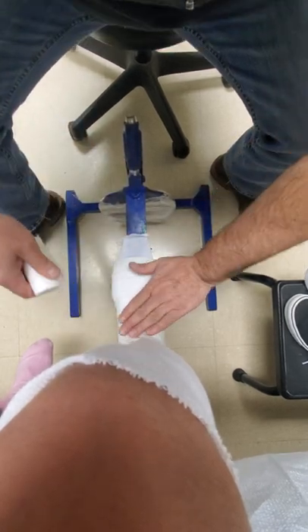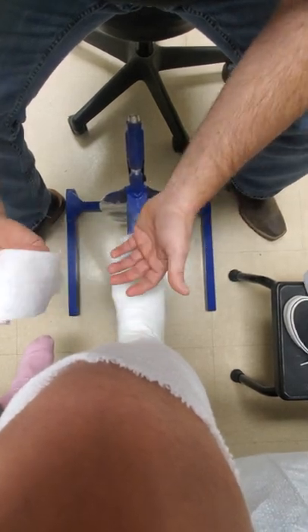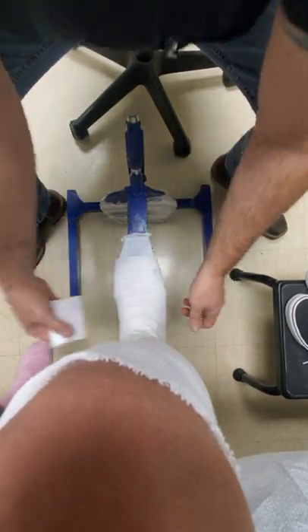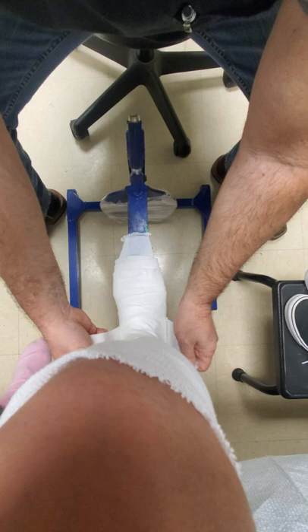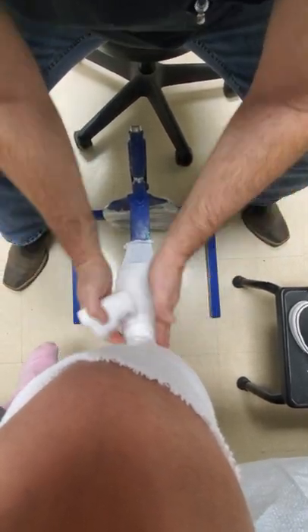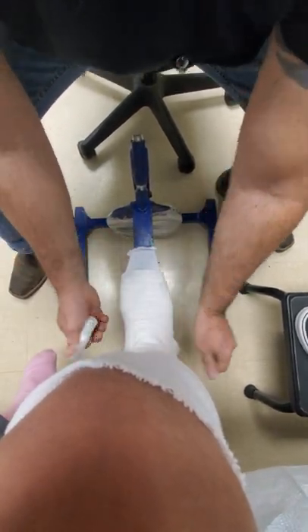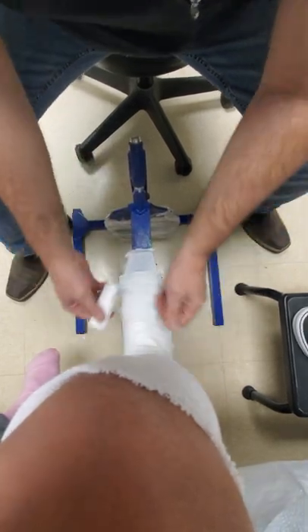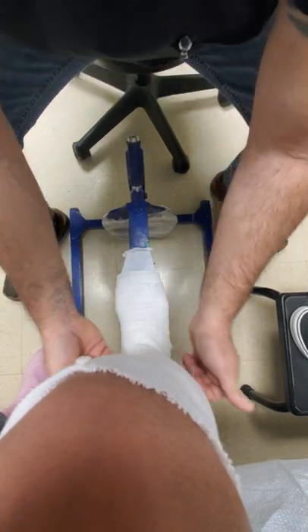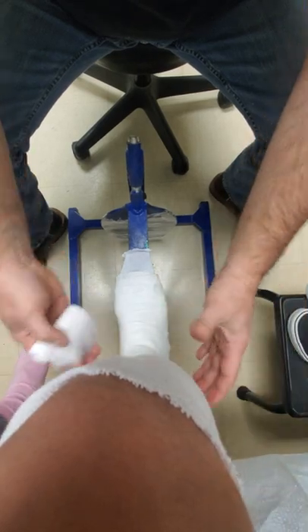The whole point is you don't want too much interruption at the fold. The strips are just as easy — you take the padding and cut it into strips. If you're going to do the strip method, make sure you go all the way up over the lateral and medial malleolus so it covers the ankle bones. Also make sure to do a few strips on the top surface as well so they don't get a rub there from the fiberglass. We'll work our way up the leg, pad the whole leg, and then move on to the next step.